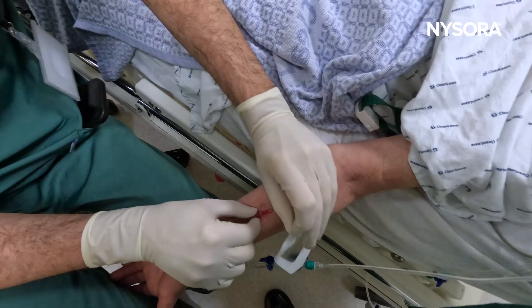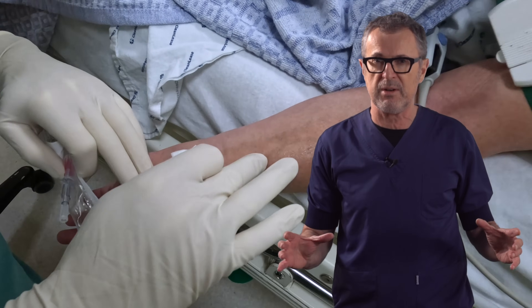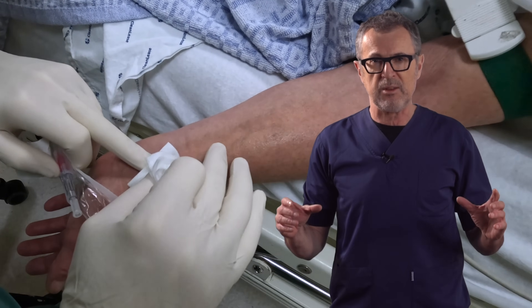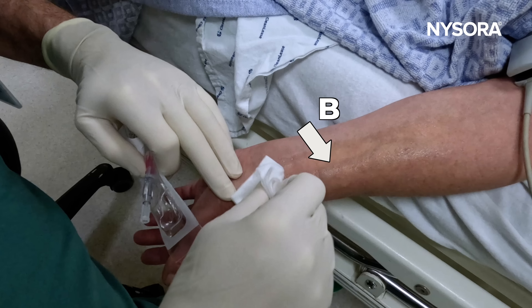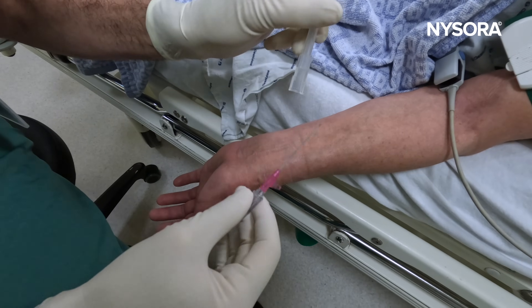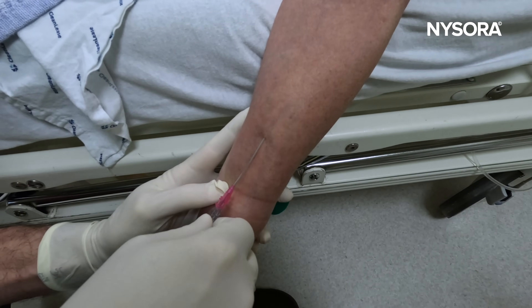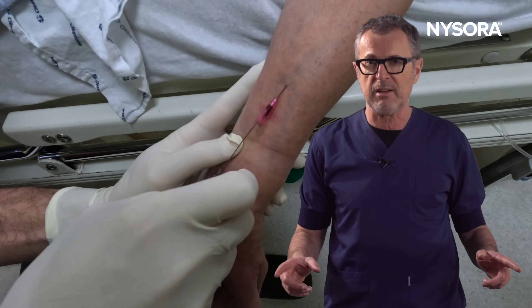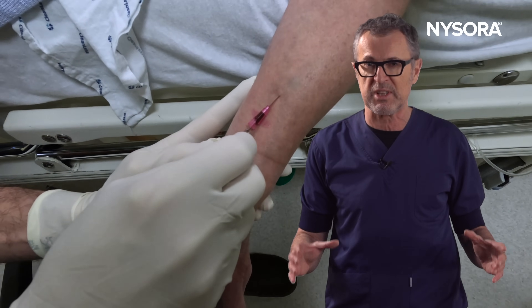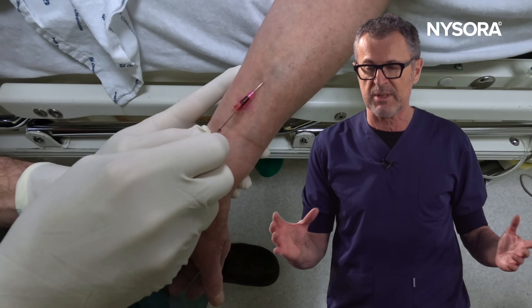In this video, we're going to talk about difficult venous access. I'm going to go through a number of choices in a difficult venous cannulation patient, where you will have to vote which vein you would prefer for cannulation. We're going to execute the cannulation and demonstrate the technique, including where you should choose the insertion point for your needle to prevent the vein from rolling. Finally, we're going to deal with the problem where the catheter is inserted into the vein but cannot be advanced due to the valve inside the vein.